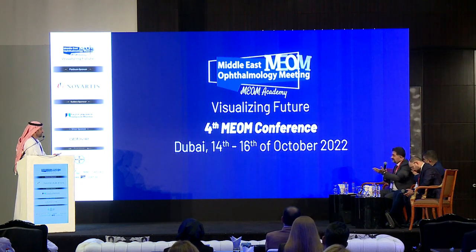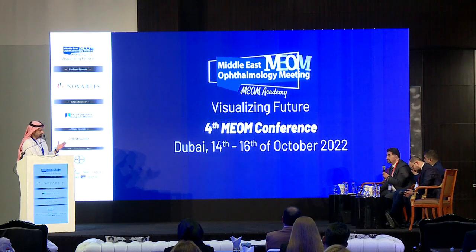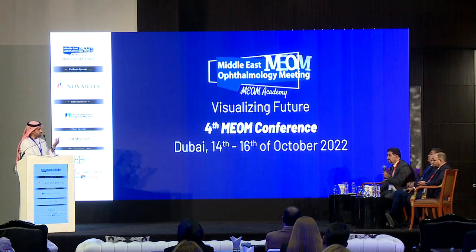Before the ICL, do you try hard contact lens or contact lens first to make sure that the patient with the contact lens is going to see better, or do you go directly for the ICL? Well, for these patients, definitely I don't jump to ICLs. As I mentioned earlier, patients might be intolerant to contact lens. They might see excellent. We all know that anybody with an irregular surface will never have a good quality of vision like they do with hard contact lens.